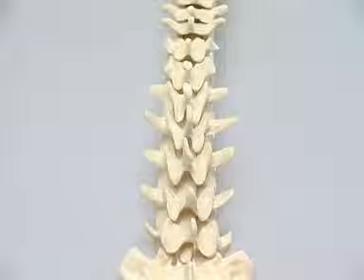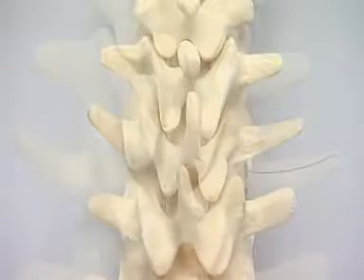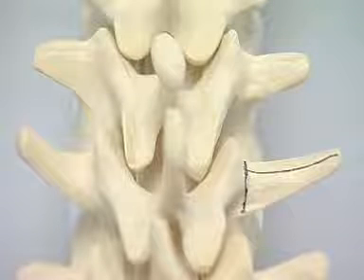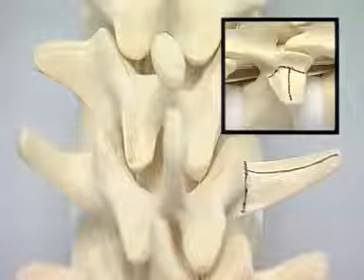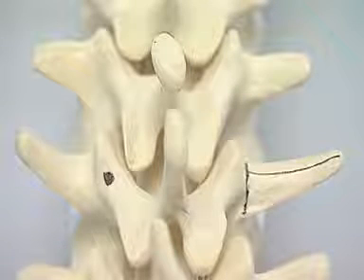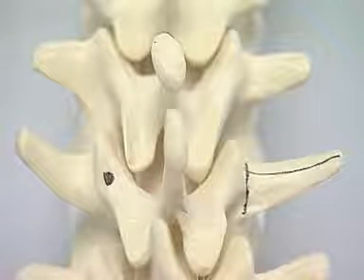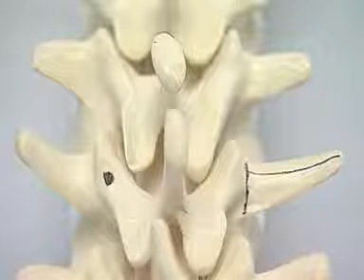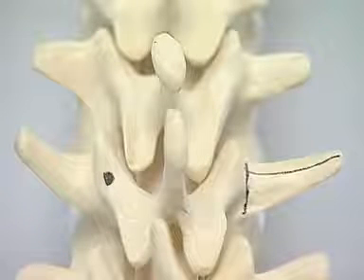To illustrate lumbar pedicle screw insertion, start with the L2 vertebra. On the right-hand side, mark the two lines on the spine: the first tangential to the outer border of the superior articular process, and the second bisecting the transverse process. The intersection method gives a more lateral entry point. A more medial entry point at the junction of the isthmus and the superior articular process may be used. In vivo, a small accessory tubercle may be present to aid identification of the entry point. This more medial entry point allows the angle of screw insertion to be closer to the median sagittal plane, but cannot be used at the proximal end of any construct.